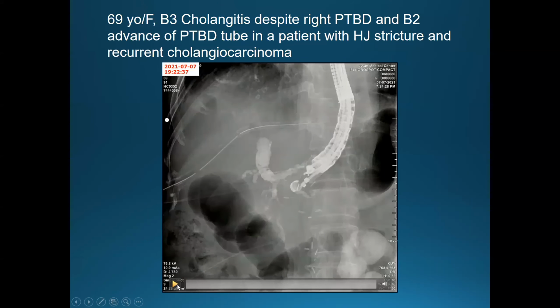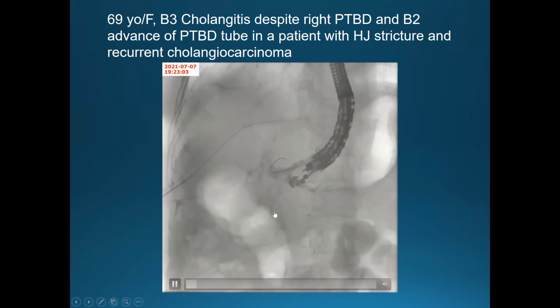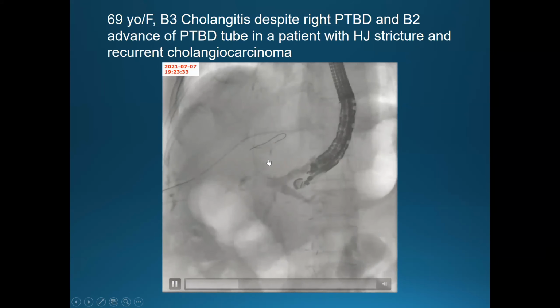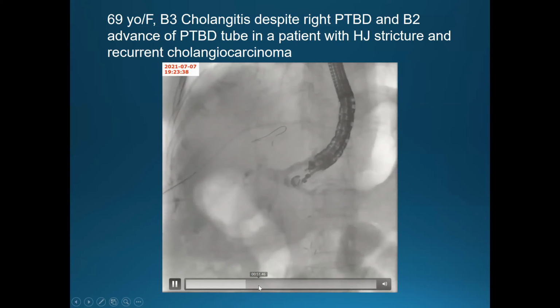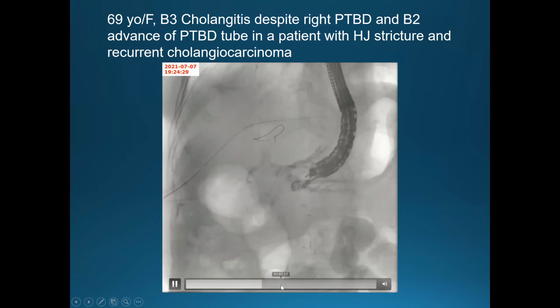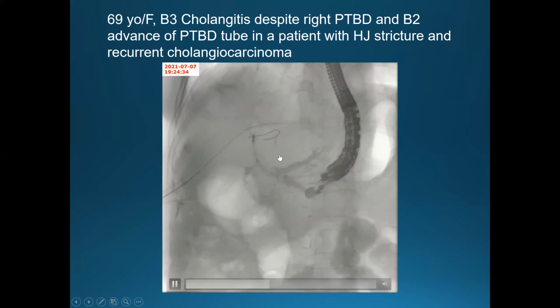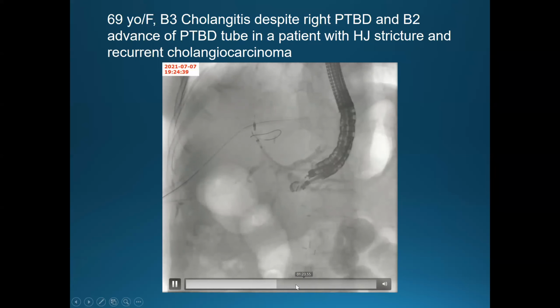So I performed EUS-guided HGS for this patient. When I punctured the B3 and used the 0.025 guide wire, I then performed it with a partially covered stent. Here there is some focal and segmental stricture of the B3 position. Here is a one-step device for HGS, partially covered with distal flaps. It's very easy for HGS even though it is a very angular position.